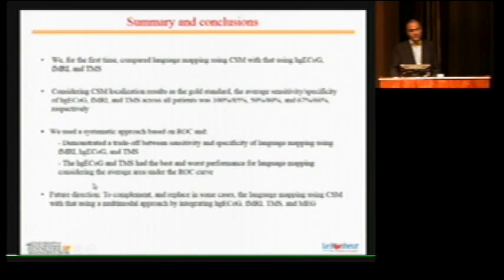As a future direction, we aim to complement and replace the invasive method of language mapping using the CSM with another less invasive or more sensitive method like high gamma ECoG, fMRI, TMS, and MEG.